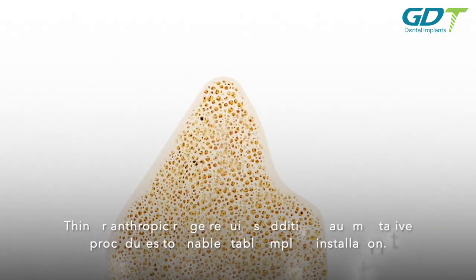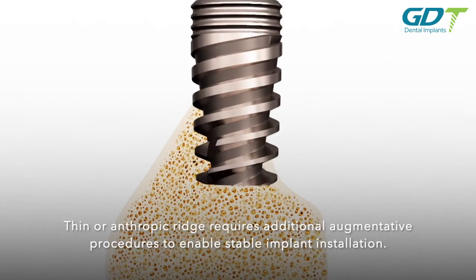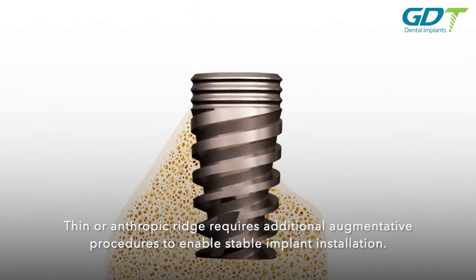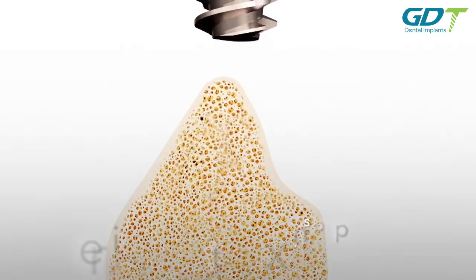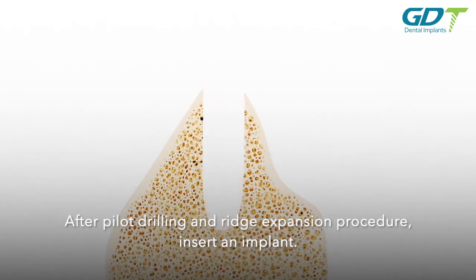Ridge augmentation technique: a thin or atrophic ridge requires additional augmentative procedures to enable stable implant installation. After pilot drilling and a ridge expansion procedure, insert an implant.